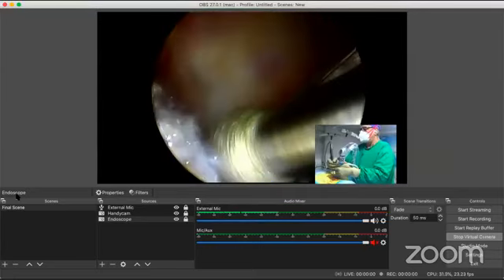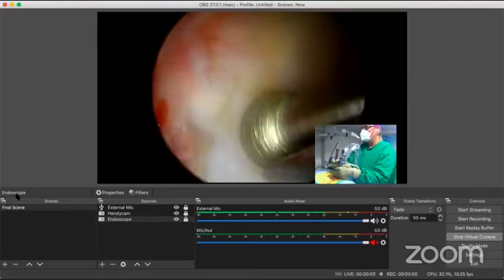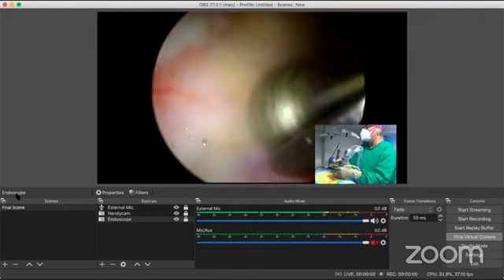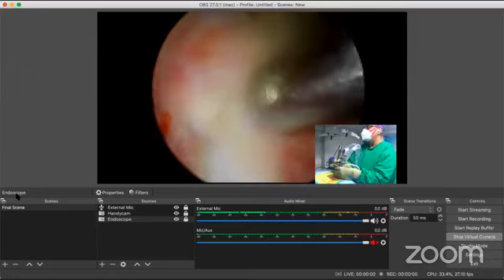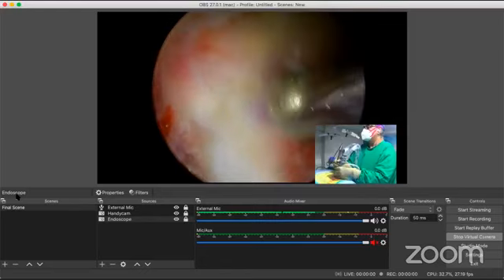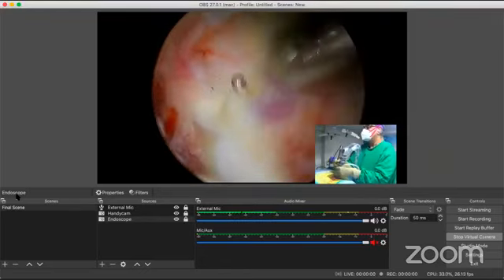Slowly, I'm going about my job. I'm not hurrying it up. There's no room to hurry here. The slightest of hurry can create a big mess. You just keep on thinning the lamina.